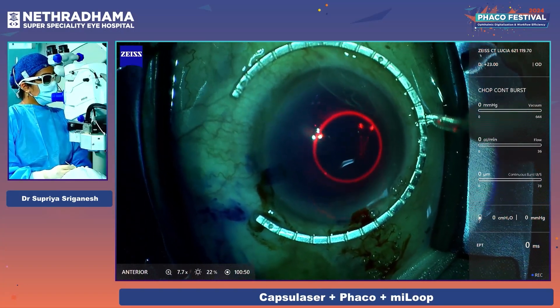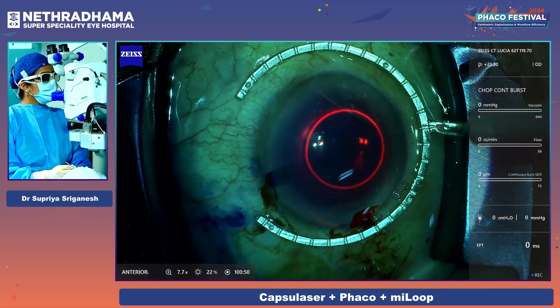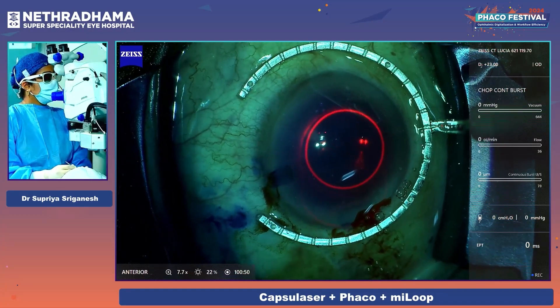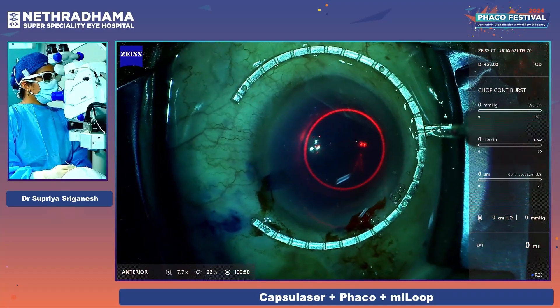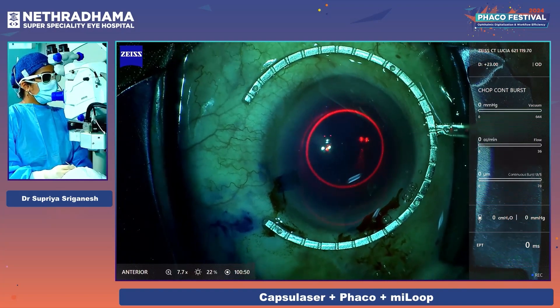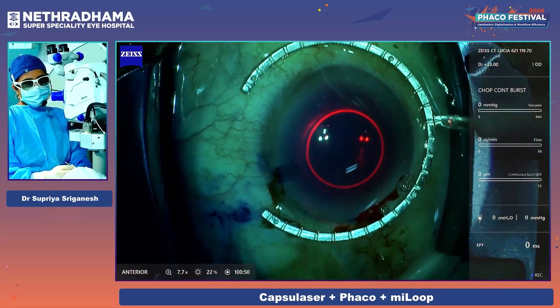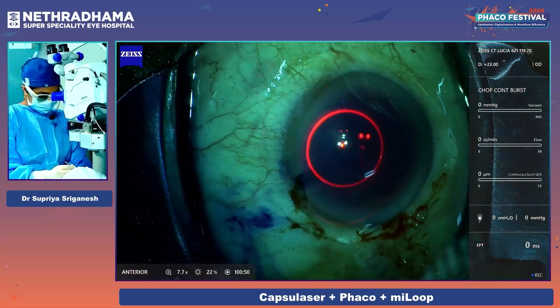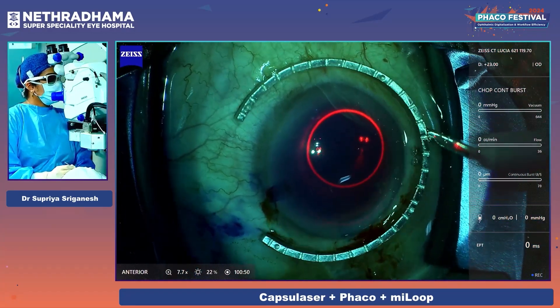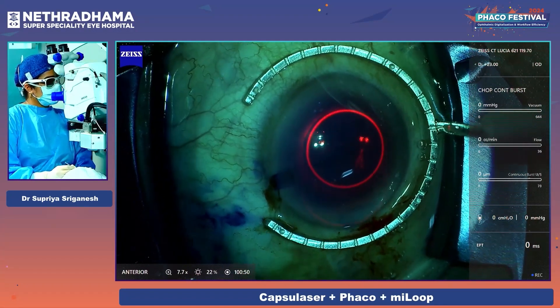I'm just focusing the laser — the two dots need to focus on the anterior capsule. Can you see the anterior capsule? I'm also — it's not very clearly seen but you can see the red dots that are clearly focused on the anterior capsule. Can you see the red dots? That are — for us it is not in the center, it's slightly to the right side. Maybe it's camera parallax. Now we can see it coming to the center. The red dots are visible — two of them are on the cornea, two of them are on the capsule.